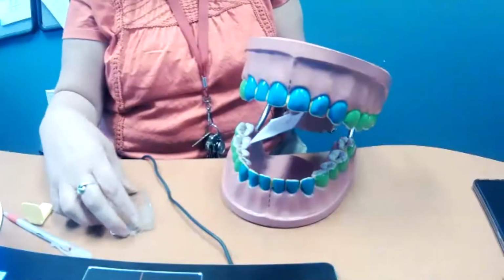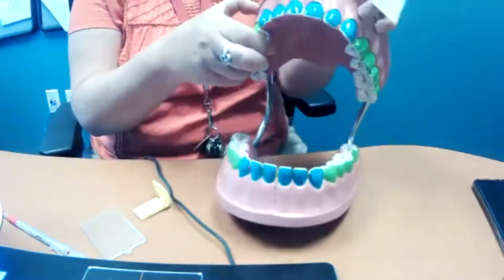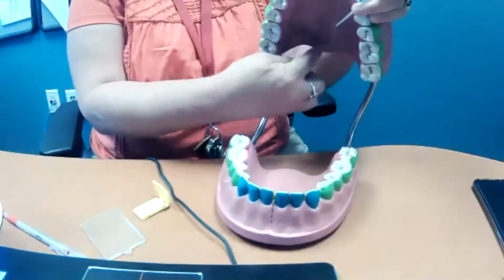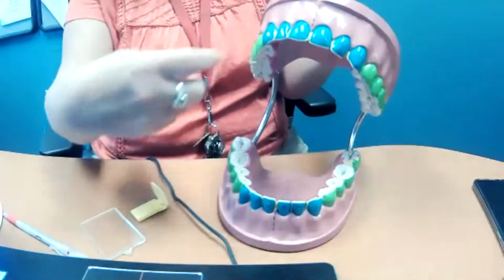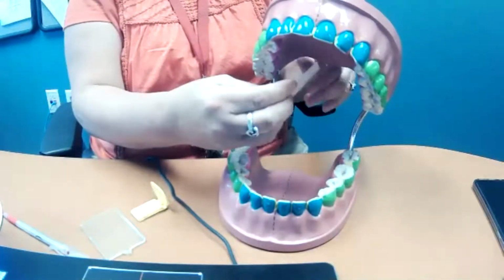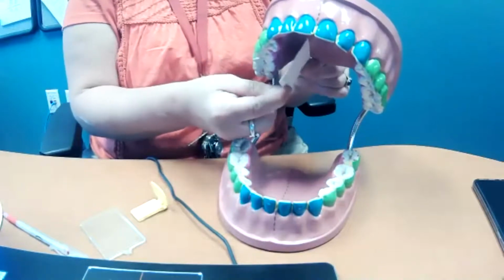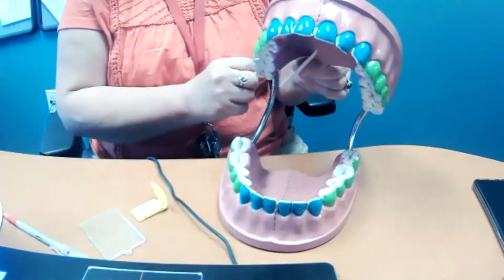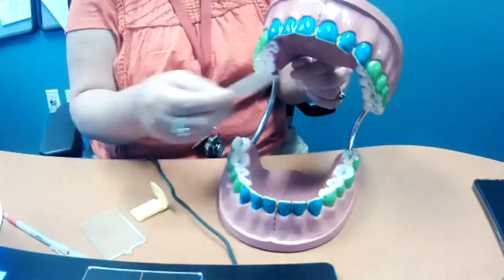And what you need to do is make sure that you put it enough towards midline so that we can get the curvature of the teeth, but we can also make it far enough away so that the film doesn't bend and we make sure we don't get any distortion.